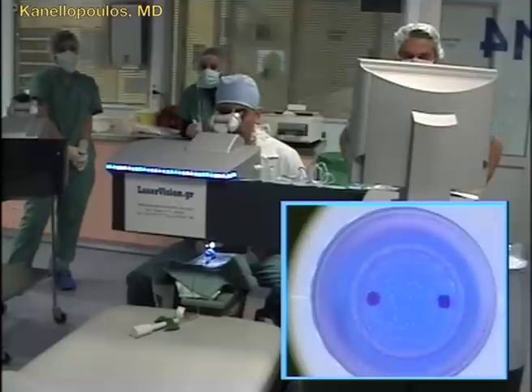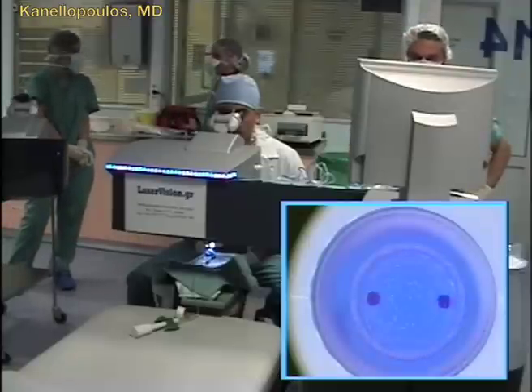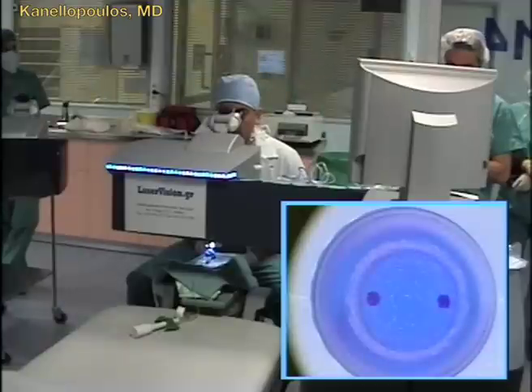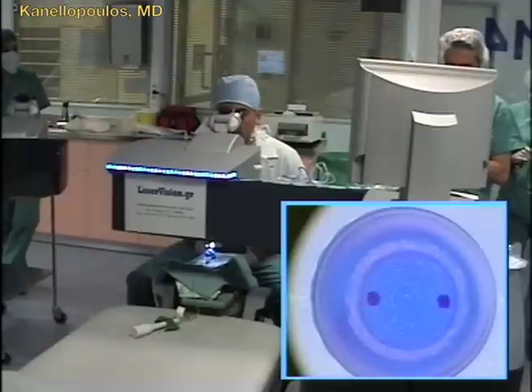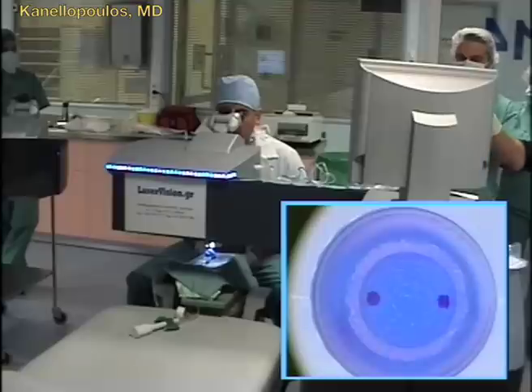Trefination starts from posterior to anterior. And you can see how well it is centered to the two air pipes within the artificial chamber.